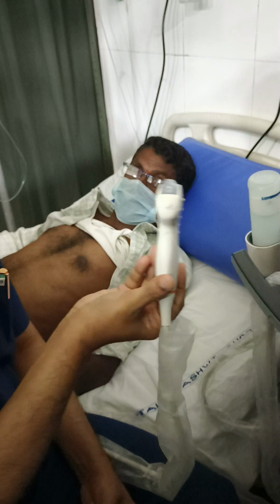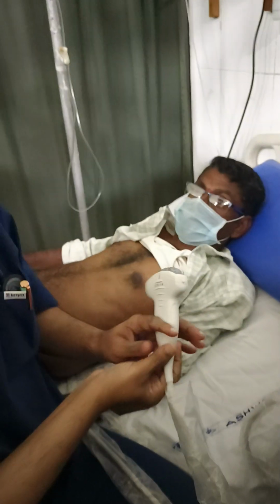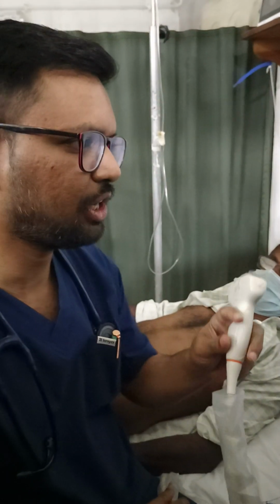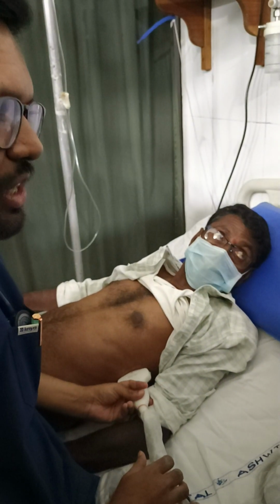Now I am placing the probe on the suspected side of pneumothorax. We are suspecting pneumothorax on the left side. So I am placing the same curvilinear probe in the infraaxillary space on the left side.